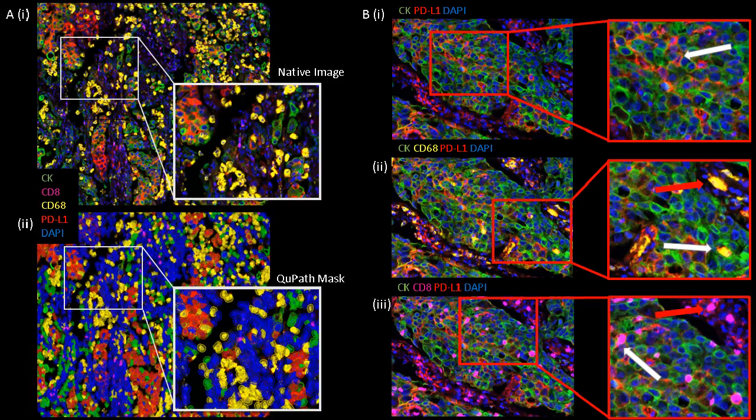And again, this would be a data point that would be excluded from the analysis. And then we also have macrophages that are outside the tumour nest in the stroma, which may have prognostication and is something that we're investigating in our research questions. But for a clinical assessment, we definitely need to discount the intrinsic macrophages inside the tumour nests.